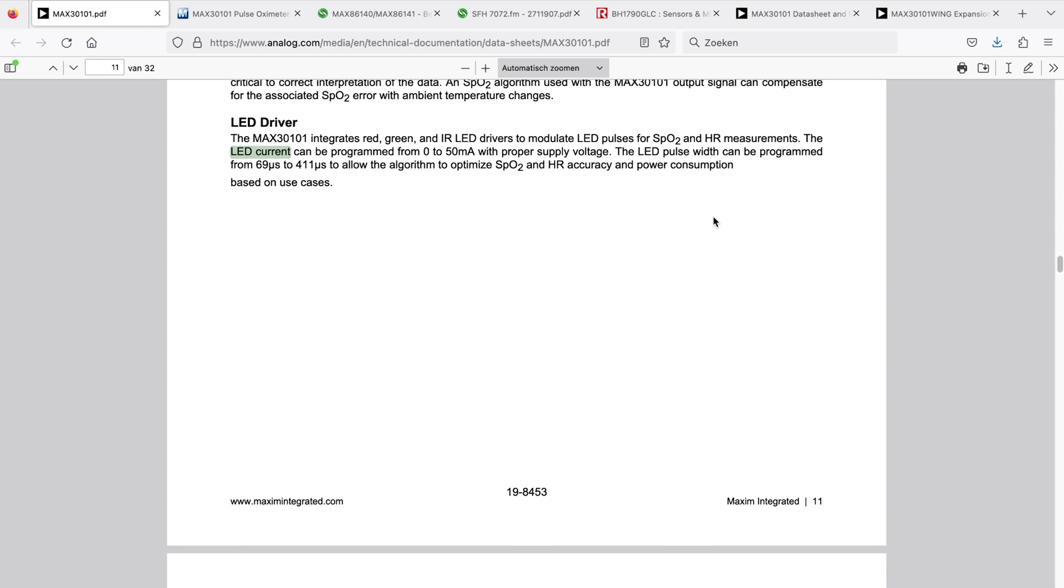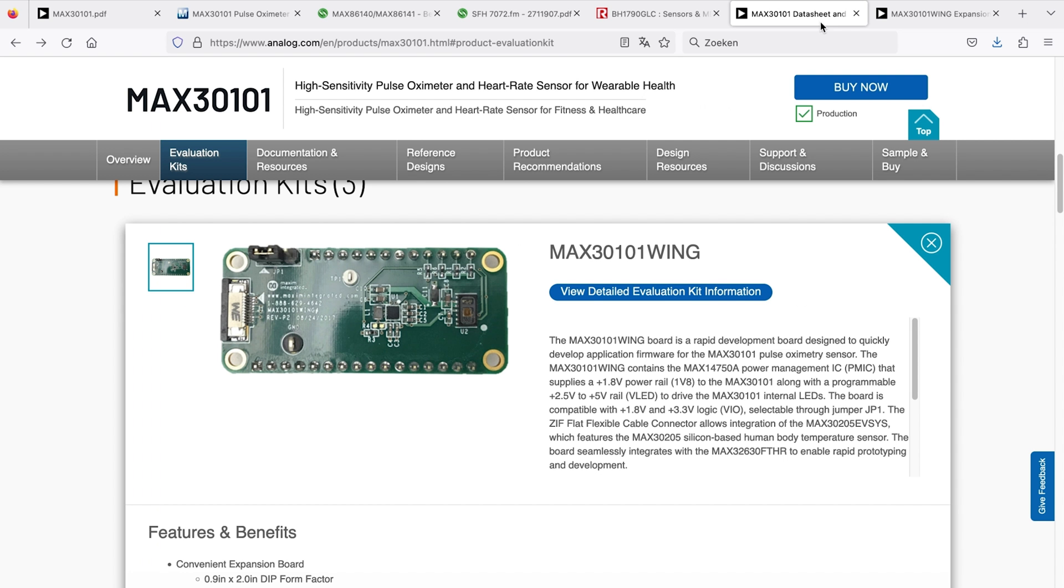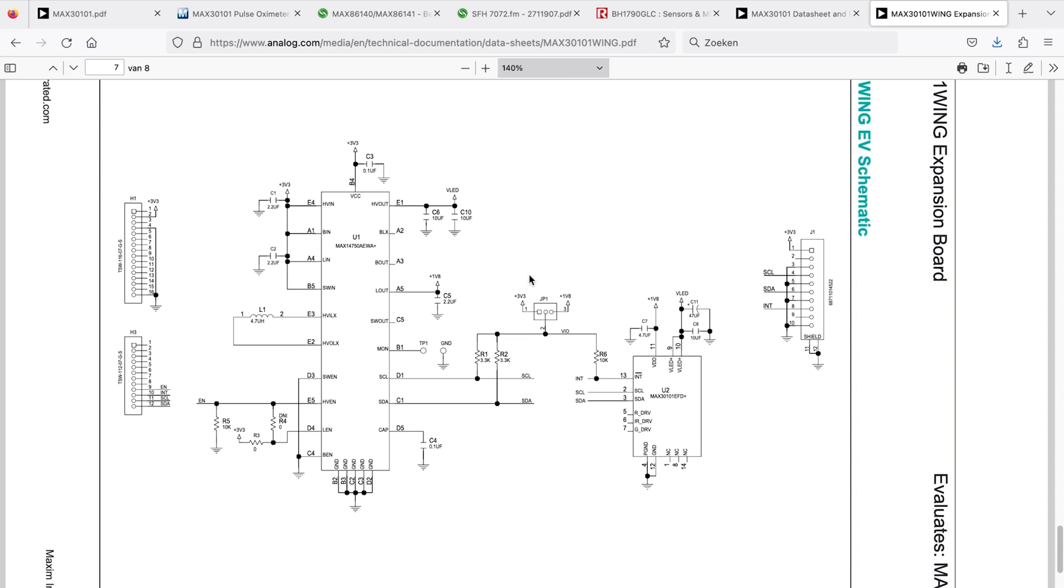Evaluation boards exist, typically for any IC you can think of. So this might be an interesting one to test. There is also one for this one. And what is very interesting for us is that there is already a schematic provided.